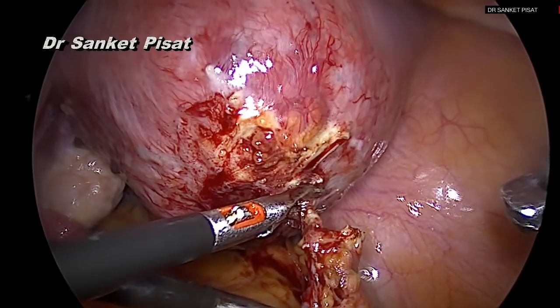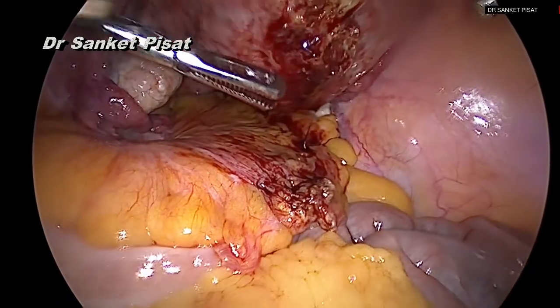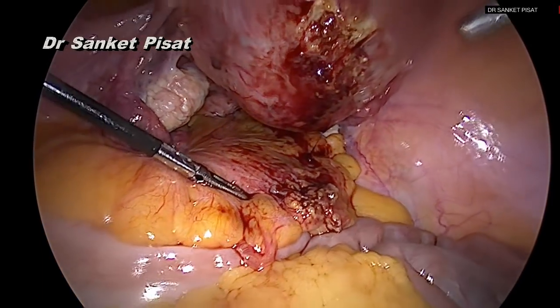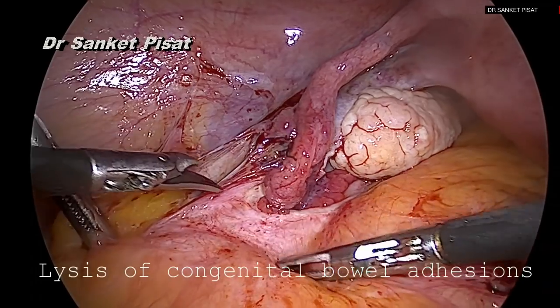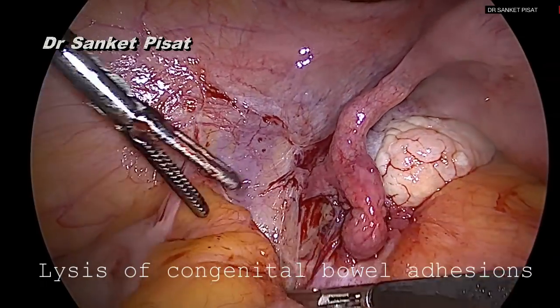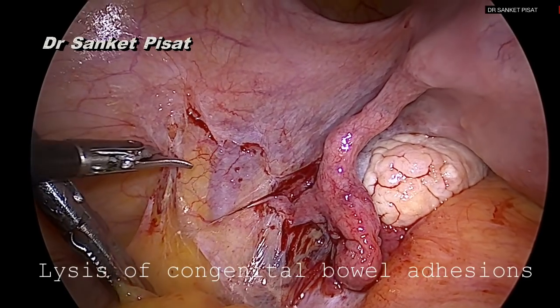This is the same instrument that we are going to be using throughout the duration of this surgery. After doing the required adhesiolysis, we start taking a look at the lateral pelvic wall where the uterine artery ligation is going to be performed. The first step in this is lysis of the congenital bowel adhesions.